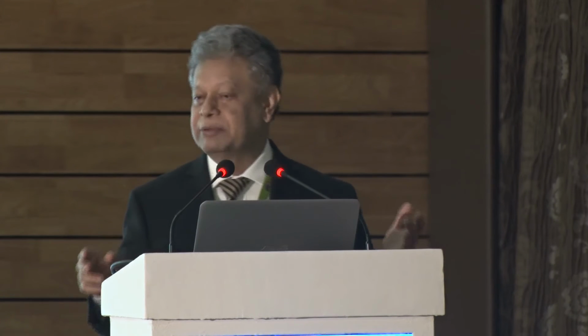And we know about this: 1 degree, there is 3% loss. In 10 degrees, about 30% loss, and at 30 degrees, total loss. So we have to be sure that there is no rotation.